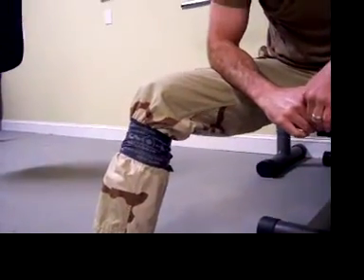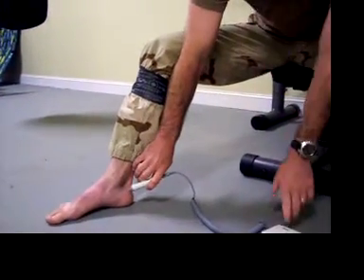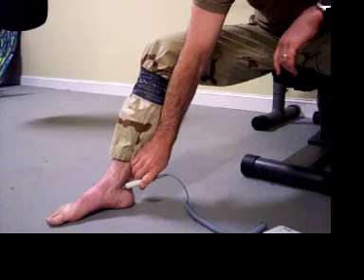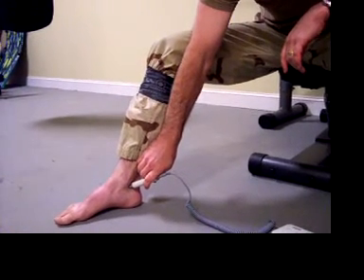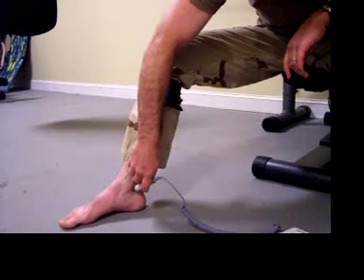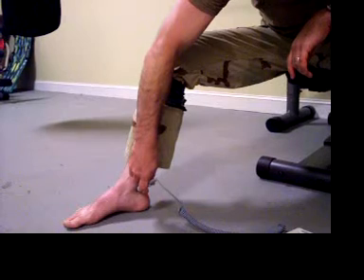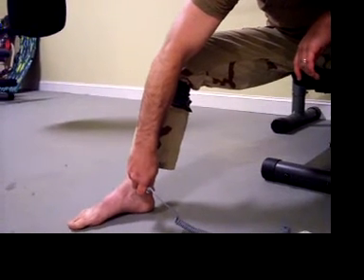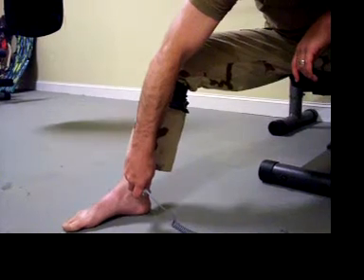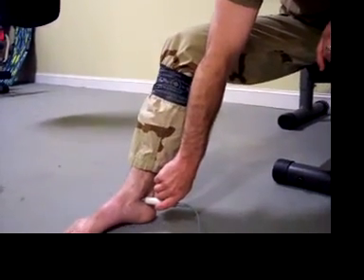The SWAT-T is now secured into place. We'll reconfirm Doppler signals to show that the SWAT-T is fully functional, fast and effective. There is no arterial pulse present.